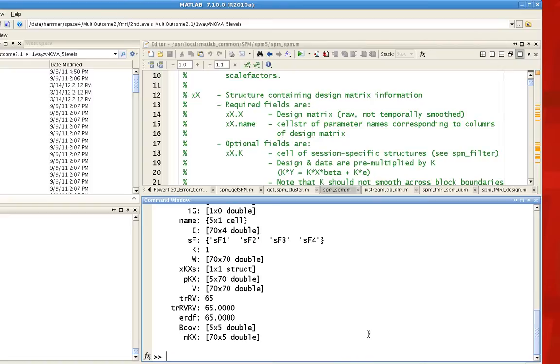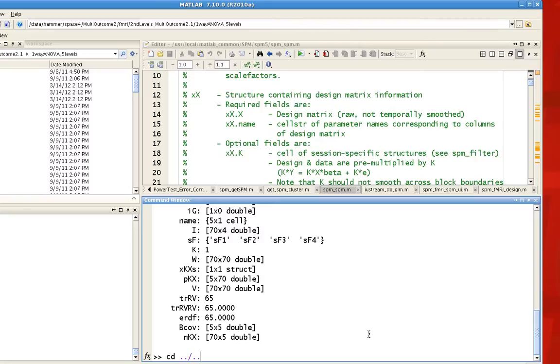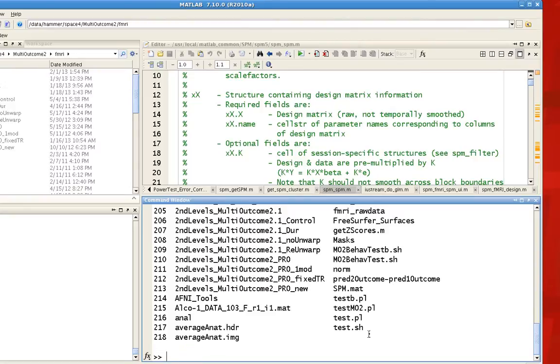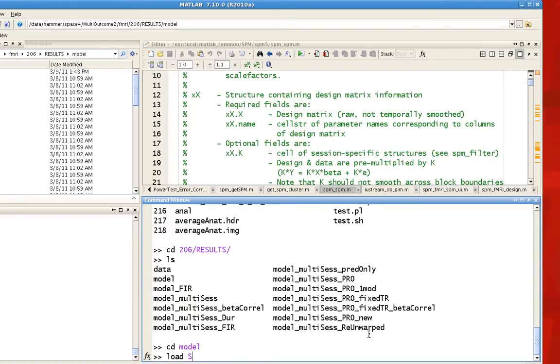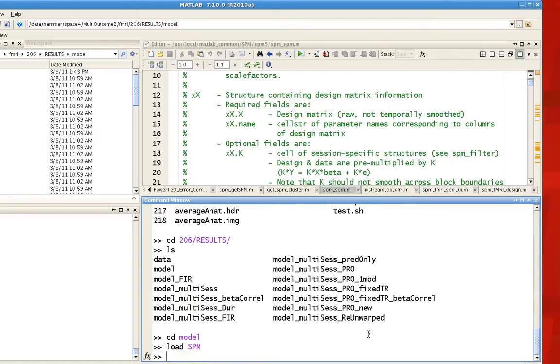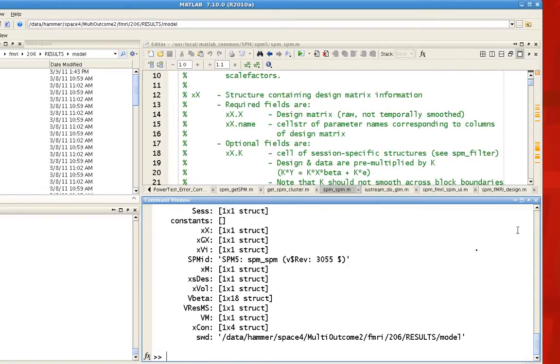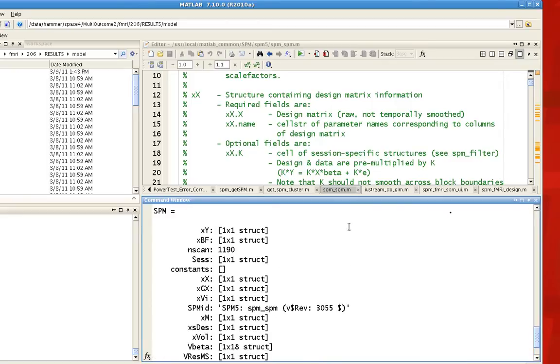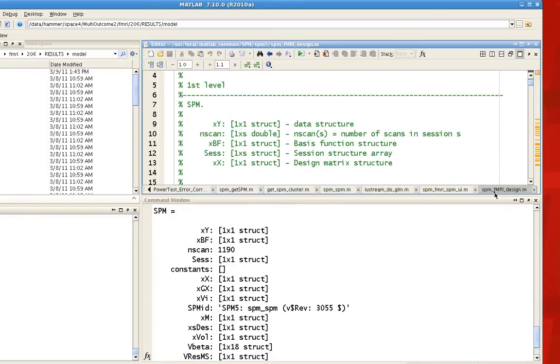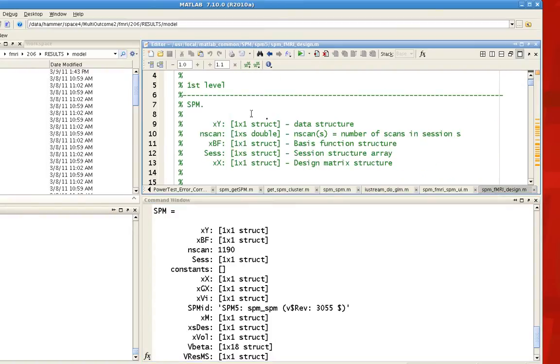Now for first-level analyses, you also have additional information about things like the basis function. So I'm going to go into an individual subjects directory here and load their SPM. So you can see that it has XY, XBF, and this is contained in a script called SPM_fMRI_design. XY is the data structure. XBF is the basis function, which contains information about what was convolved with each of your events.